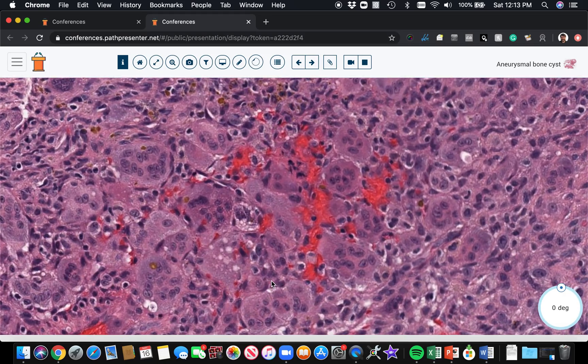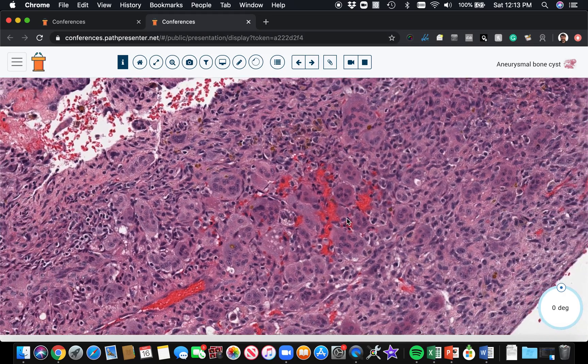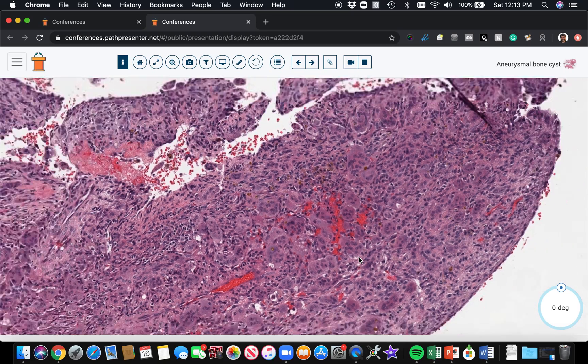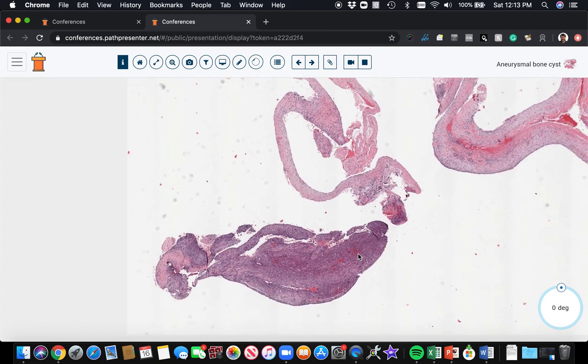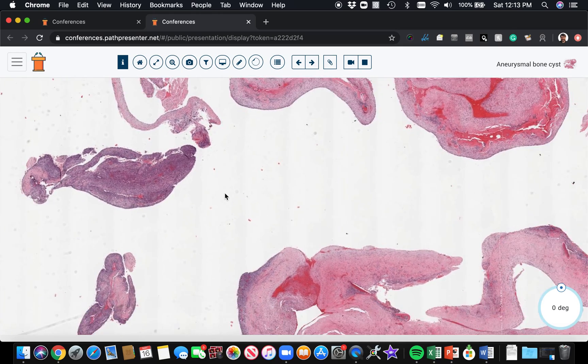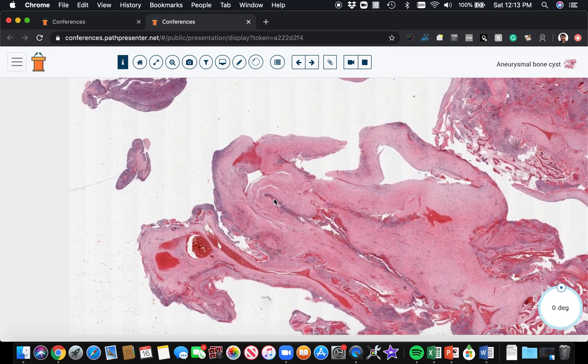Alright, here's another example or another area where we got some giant cells. See, there are a lot of giant cells here, but they're just these little pockets within the aneurysmal bone cyst.